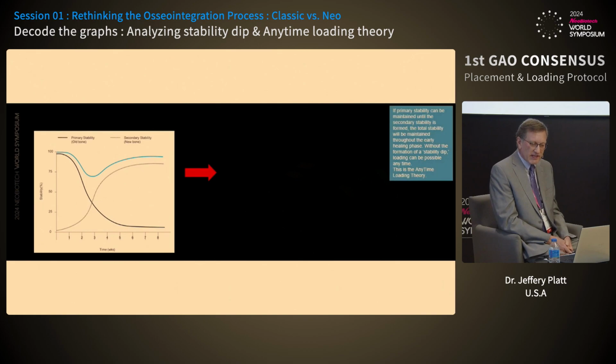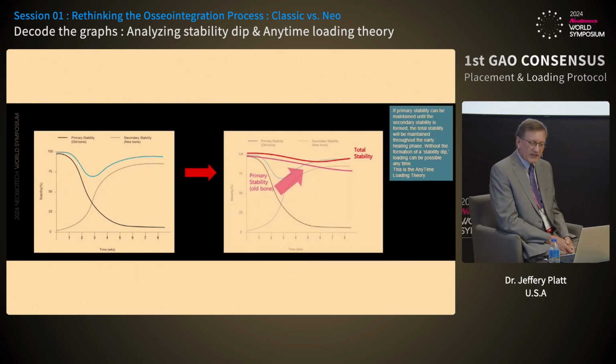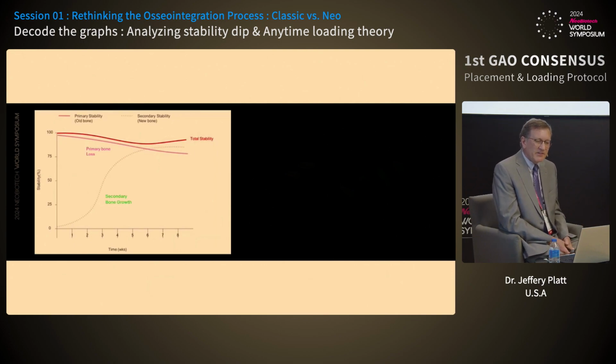by insertion of the implant with too much compression of the cortical bone, and Dr. Hall proposed that rather than losing more bone to pressure necrosis on the primary stability curve, he actually changed the primary bone loss to very minimal and changed it from 90% bone loss to about 15 to 20% bone loss. This theory was life-changing to dentists who began following him and this theory.